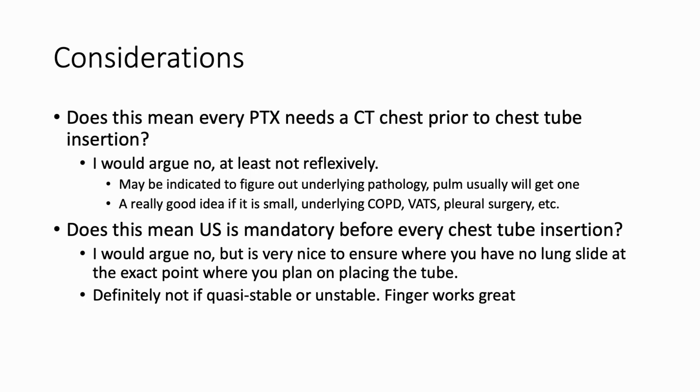I think it's a really good idea if it's a smaller sized pneumothorax, or if there's some loculations, if they've got underlying advanced lung disease, if they've had pleural surgery, etc. And that will help guide you, if you're still going to place a chest tube, to know where the spots are that you're going to want to put the tube.